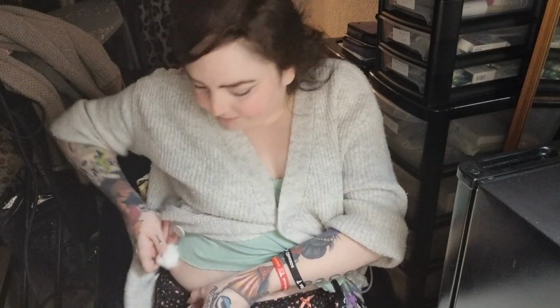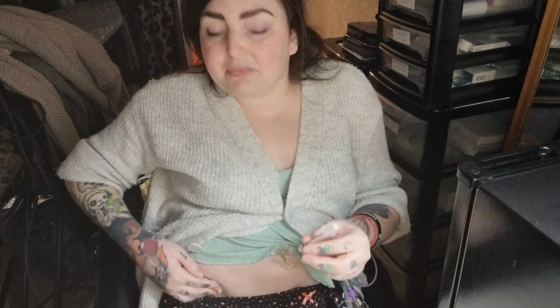You just put it in a little chubby bit, and then get your, there we go, and then dispose of that needle in a sharp bin, because you need to be safe. You don't want the bin men touching it and getting a fright, because they would get a fright. No blood. Hooray! Success!